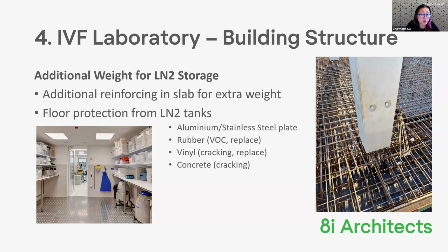Another thing is floor protection for LN2 tanks. A lot of times we try to put flooring in to protect the concrete underneath. Concrete really doesn't like thermal shock, which usually happens when your liquid nitrogen accidentally pours onto concrete. It will crack. And if it does it often enough, it'll start affecting the integrity of the concrete slab. So you want to protect the floor where you can.